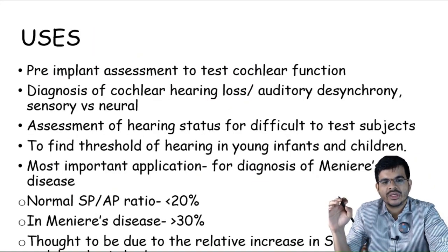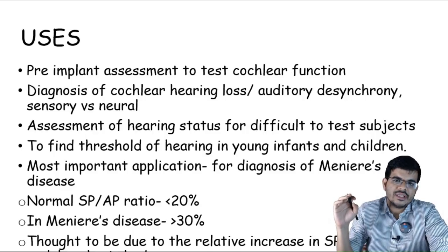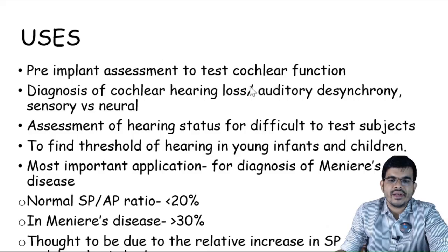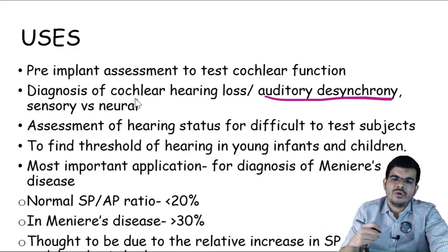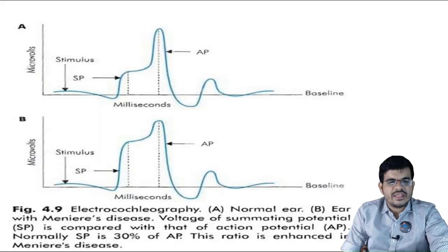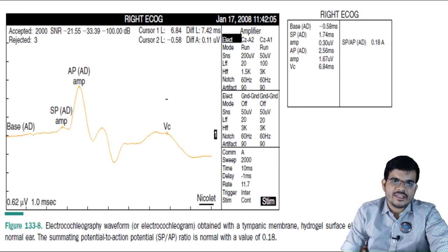So that is what is looked for mainly in this electrocochleography, and of course it can be used for auditory dyssynchrony and in pre-implant assessment to assess the cochlear function. Okay, so these are the things that you have to learn in case of electrocochleography.